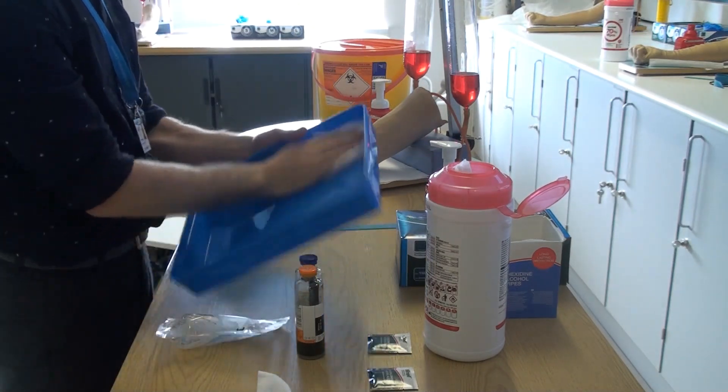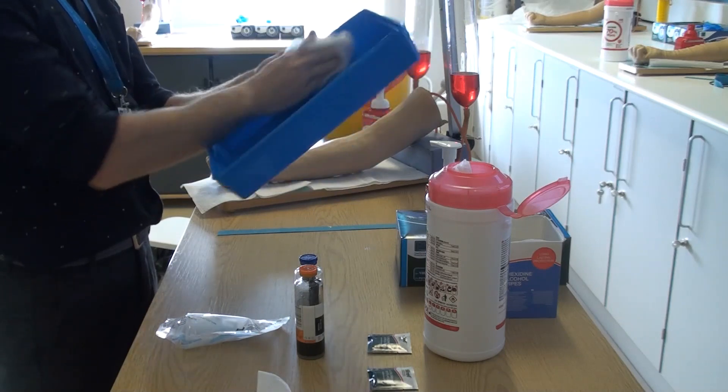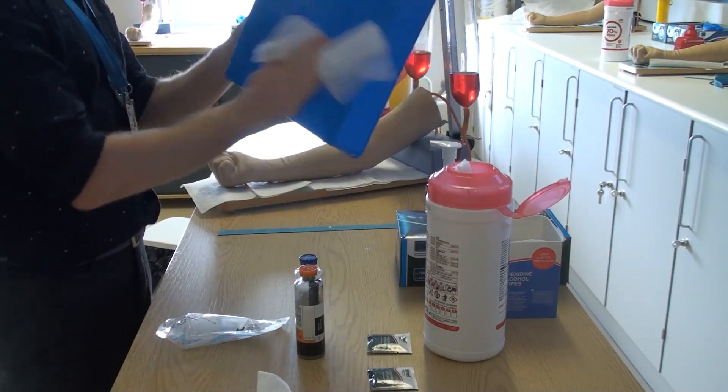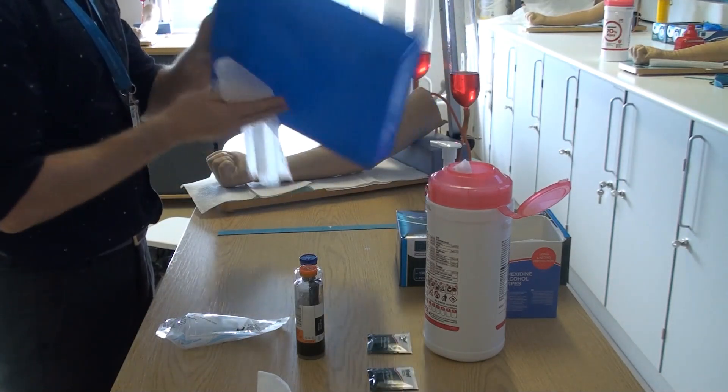Start by cleaning down your sterile field in the form of a tray or wipeable receptacle using an alcohol or sporicidal detergent wipe, cleaning front and back thoroughly.